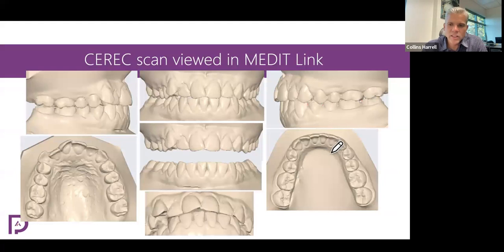And we can see that in the lower arch, we have maybe a millimeter, 2 millimeters of crowding, not much. It's a pretty good lower arch. So we're definitely not going to be extracting this patient.